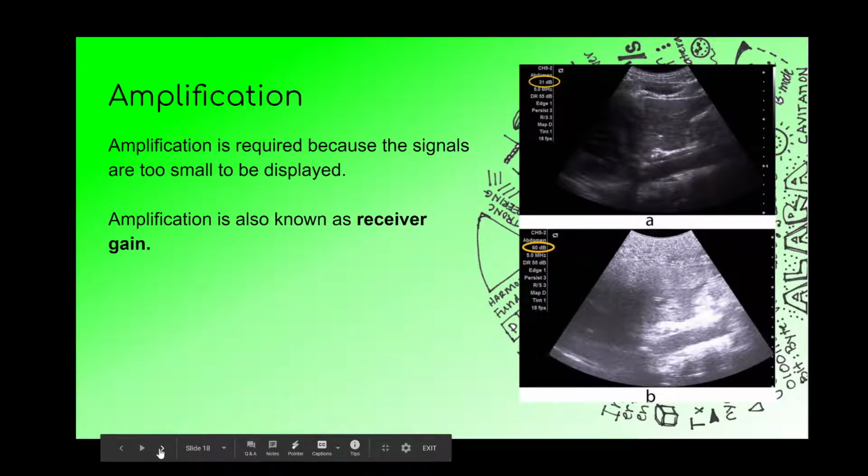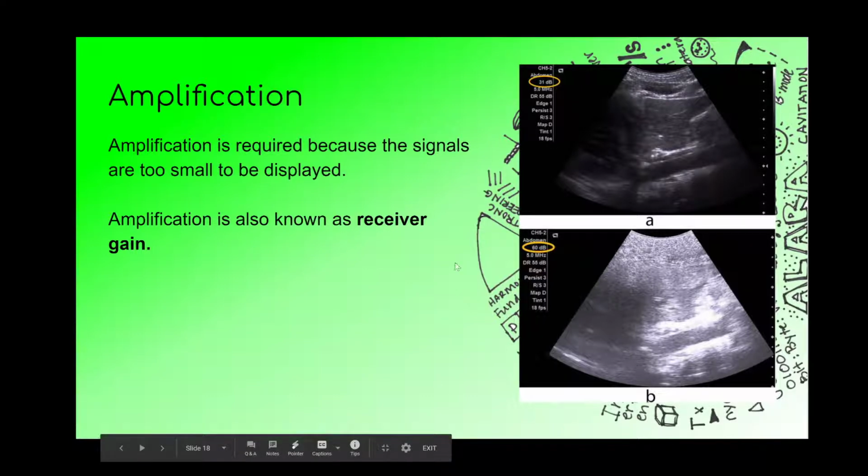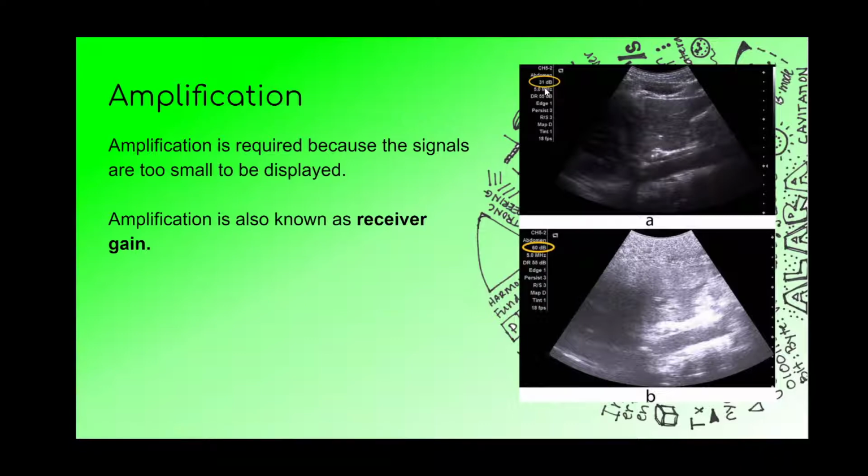As we go through these, pay attention to alternative names and whether you can adjust it as the sonographer. Our first process in the receiver is amplification. Amplification is required because those signals, those voltages that are coming back, are super weak, and all signals must be amplified, or made bigger, so the machine can use and manipulate them. Amplification is known as receiver gain. The receiver gain is displayed on your image. Typically you'll see it in decibel form somewhere off to the side. Sometimes you'll see it as a percentage as well.